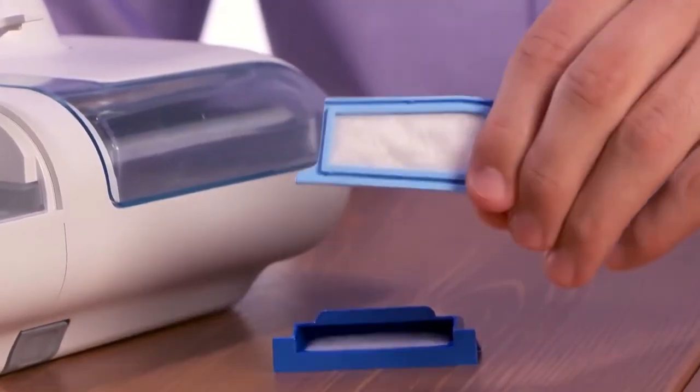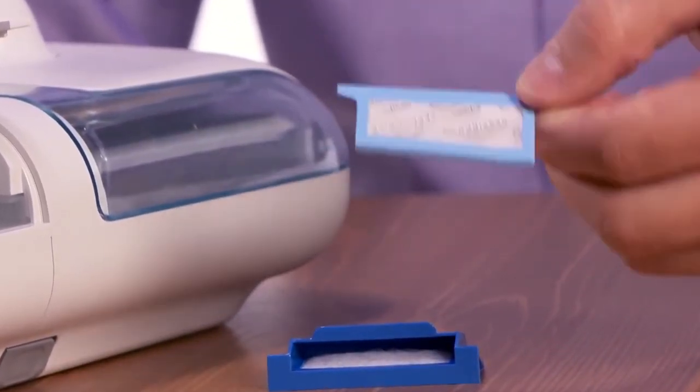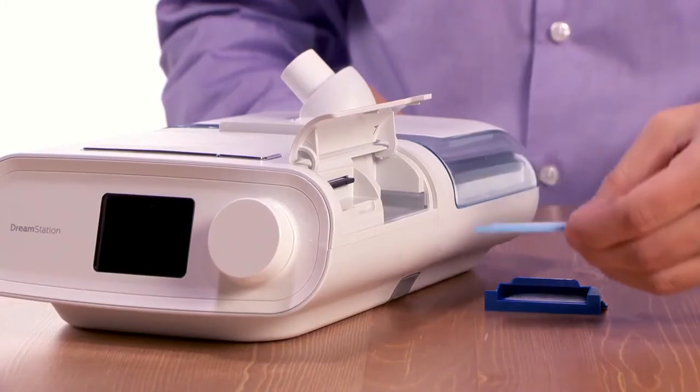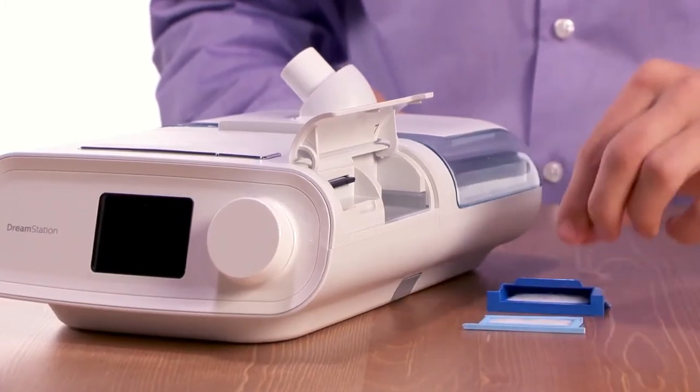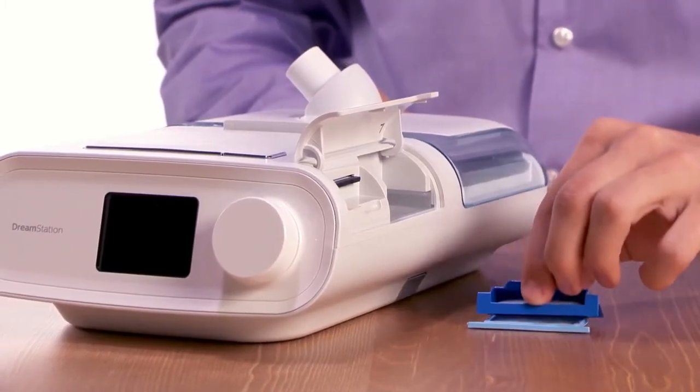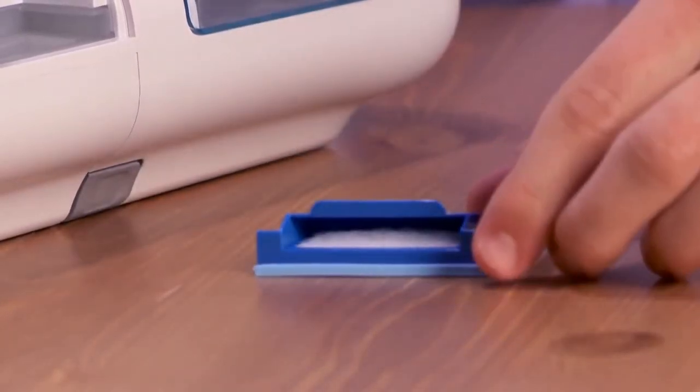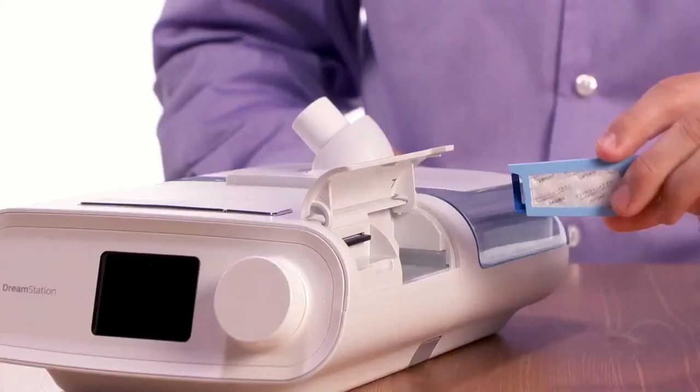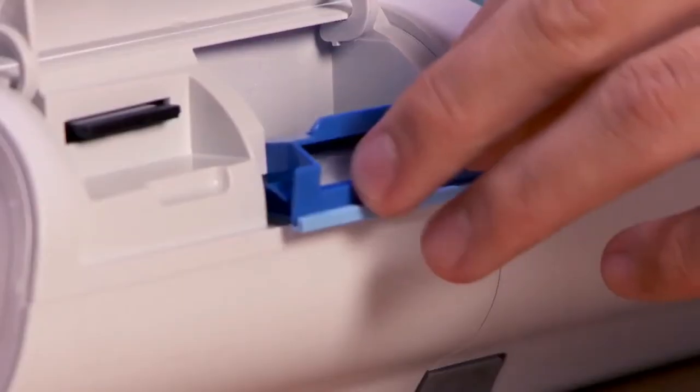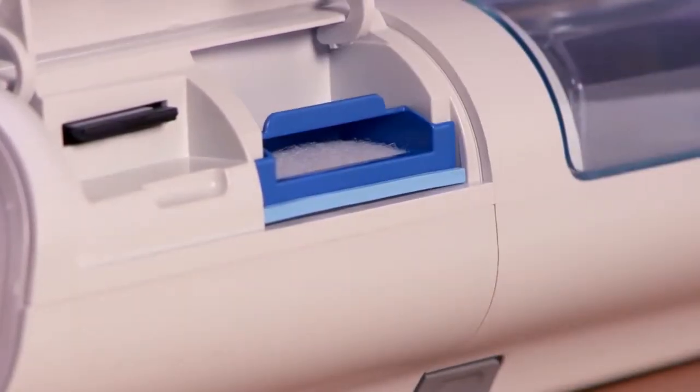The disposable ultrafine filter provides additional filtration of very fine particles. If you are using both filters, place the optional filter under the reusable one and snap them together. Put the filter assembly back into the device and swing the door closed.